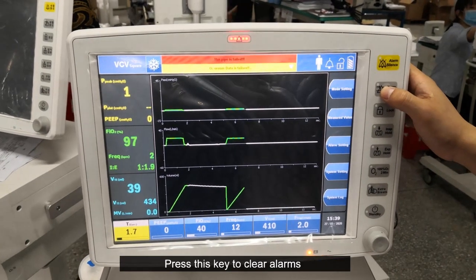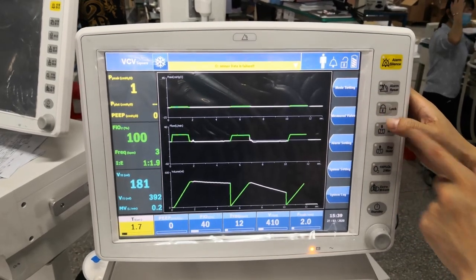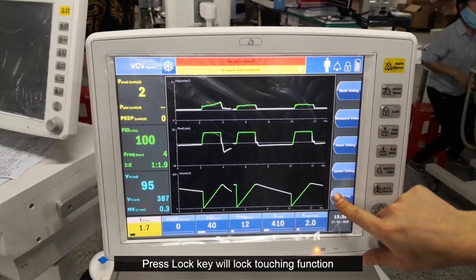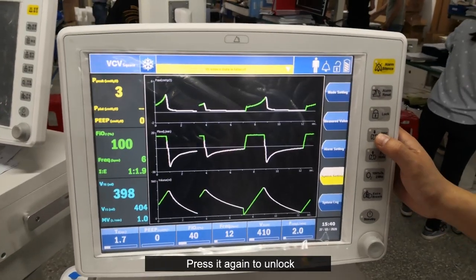Press this key to clear alarms. Press the lock key to lock the touch function. Press it again to unlock.